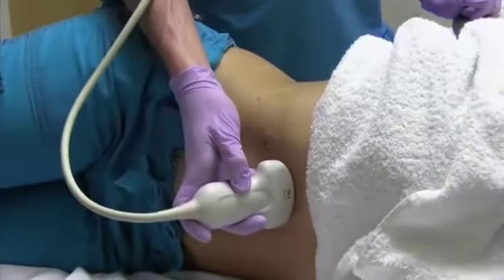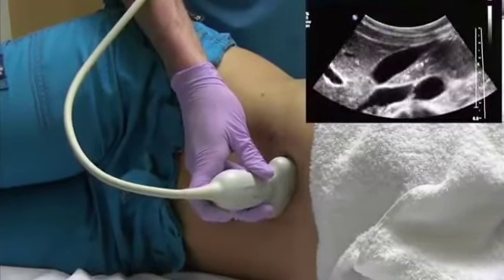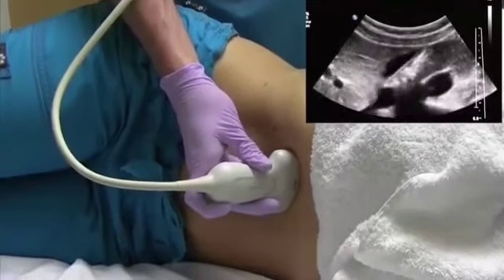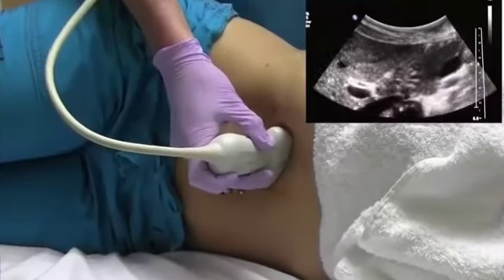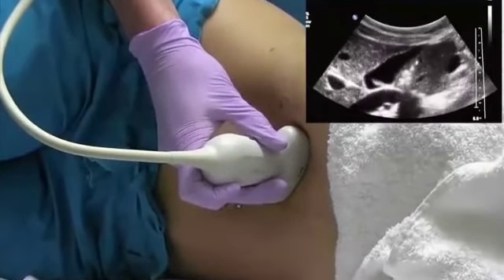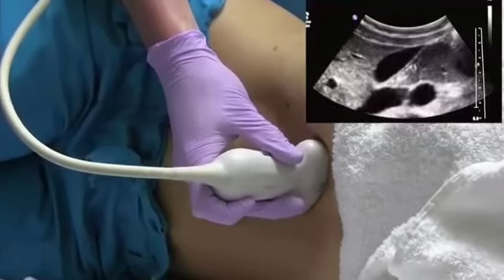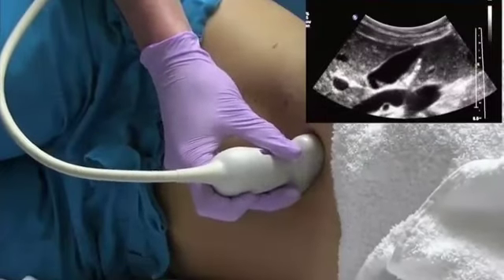So we're going to come subcostal here and sweep through, and you should see the gallbladder very anterior here. I like to start in a sagittal plane from here. You want to sweep through the gallbladder, and if there are any stones, they should drop into the fundus of the gallbladder from this plane. This is also good for opening up the neck of the gallbladder to make sure there's no stones impacted in the neck.